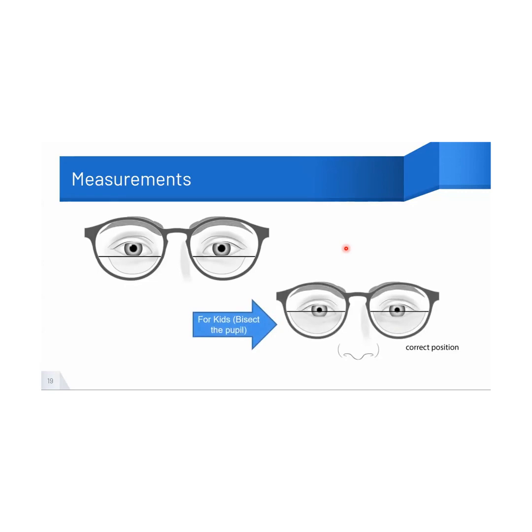The correct positioning is to bisect the pupil. Now, I would not say the responses which I got are incorrect. It depends on the distance refraction, right? If you find the child to have hyperopia, and you're suggesting an add, you would want them to reach that add at the quickest, because if there is going to be a head movement, then the compliance is going to be bad. Second thing, if the child is myopic, and you have this kind of bisection, and the myopia is greater than one diopter, then the kid would definitely not be very compliant to glasses. So have your own clinical experience added.